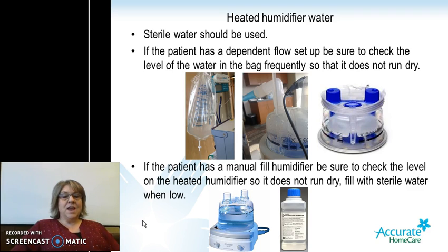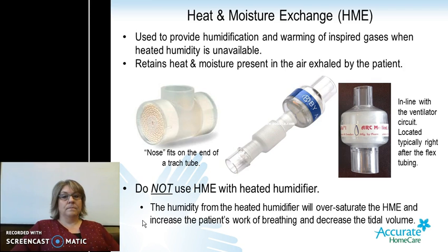If the patient does not have sterile water available, at the very least, distilled water should be used. We should not use tap water, as it does contain sediment and bacteria, even if it goes through a filtering system. Heated humidifiers are not portable. They need to be plugged into the wall.